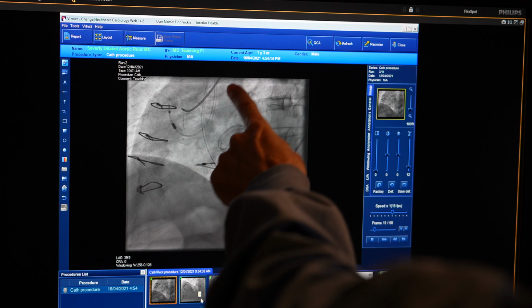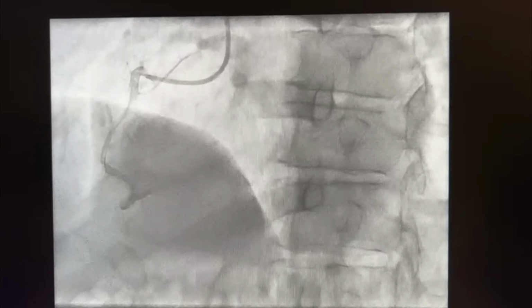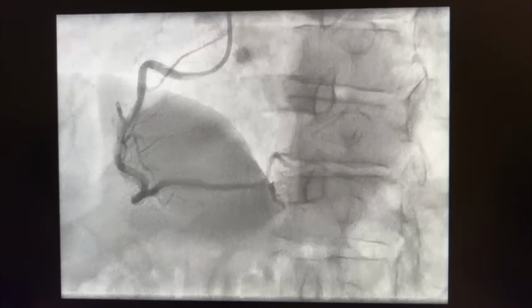During an angiogram, the cardiologist injects contrast dye into these arteries while taking X-ray pictures to see how the blood flows through these arteries. This allows them to see if you have any narrowings or blockages. To do this test, a long narrow tube called a catheter is used to inject the contrast dye directly into your heart arteries. The catheter is inserted through a short tube placed in either the radial artery in the wrist or in the femoral artery in your upper leg.